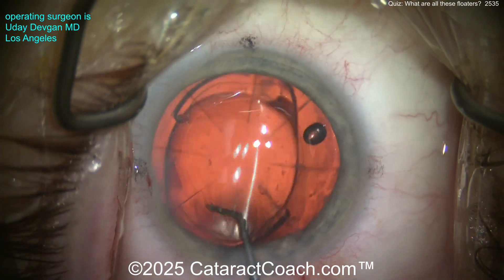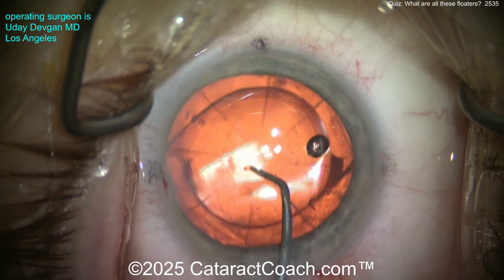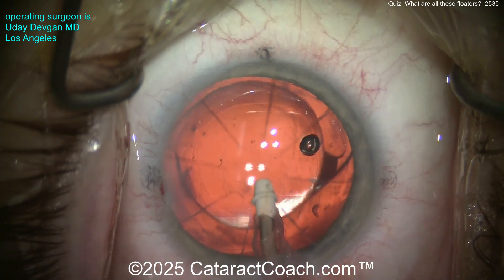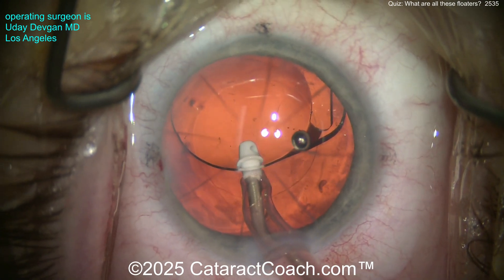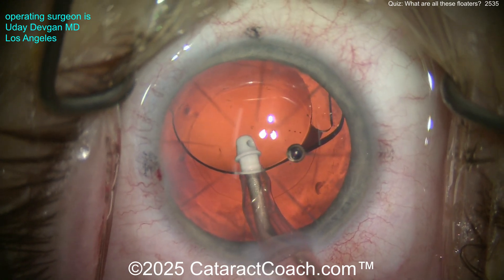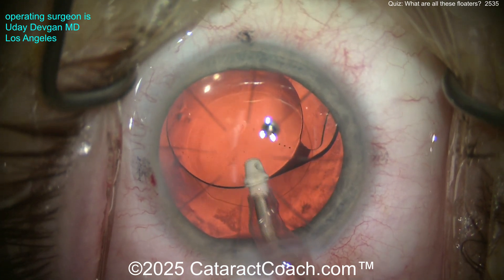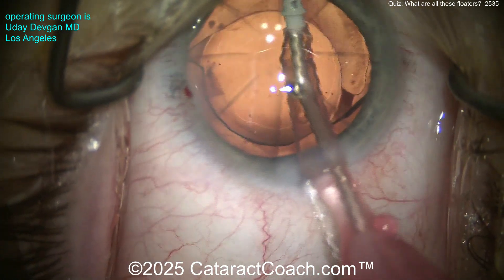I am democratizing surgical education for the anterior segment — teaching everything to everyone, giving away all the secrets. At the end of the case, we'll remove the viscoelastic from the capsular bag. This is a toric EDOF lens — extended depth of focus — so we definitely need the toricity lined up appropriately. I want the lens optic to sit right on the posterior capsule without a layer of viscoelastic between them, so it adheres and sticks in place. We'll center it up and finish the case.